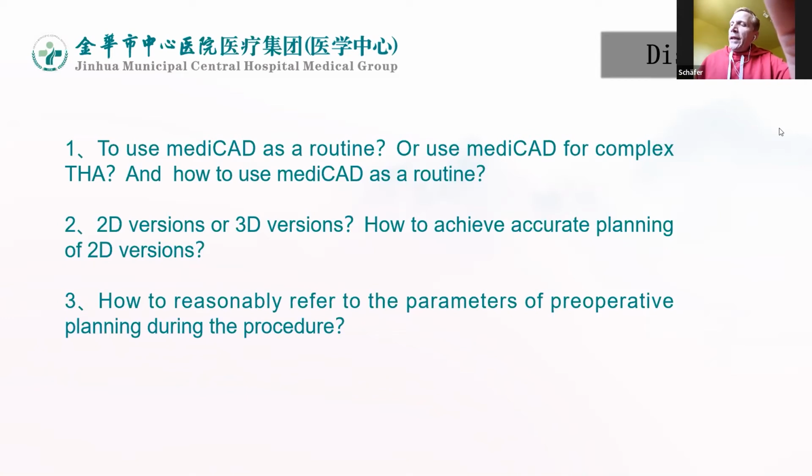I would say that the insurance companies are making this clever. They don't want to waste money. They know that with an operation plan, in most cases you use one stem, one inlay. You don't have to use more than one stem.